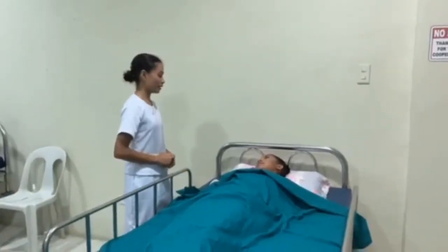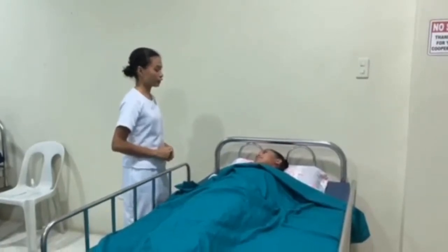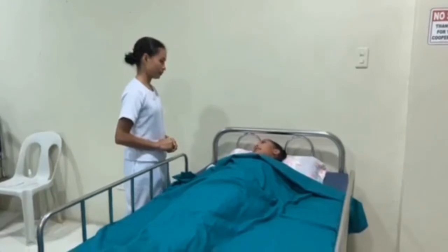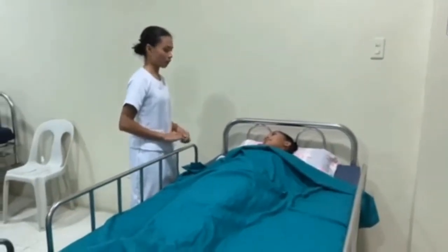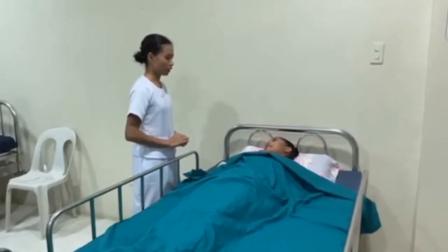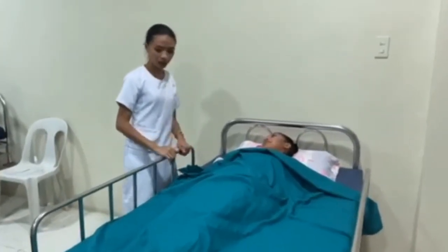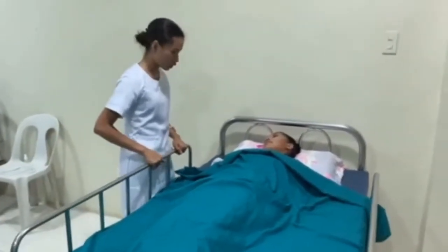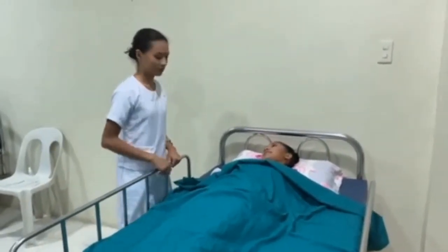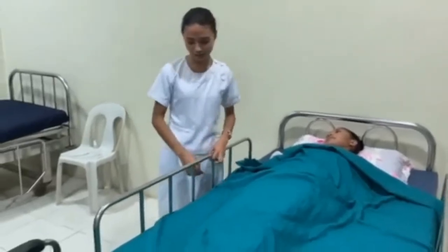So, good day, ma'am. I am Karen Tima. I will be your student nurse for today. Can you please state your name? Okay, so, what do you want me to call you? Noel. Okay, please, Noel, I will be going to transfer you from this bed into the wheelchair. Is it okay with you? Okay, let's start.